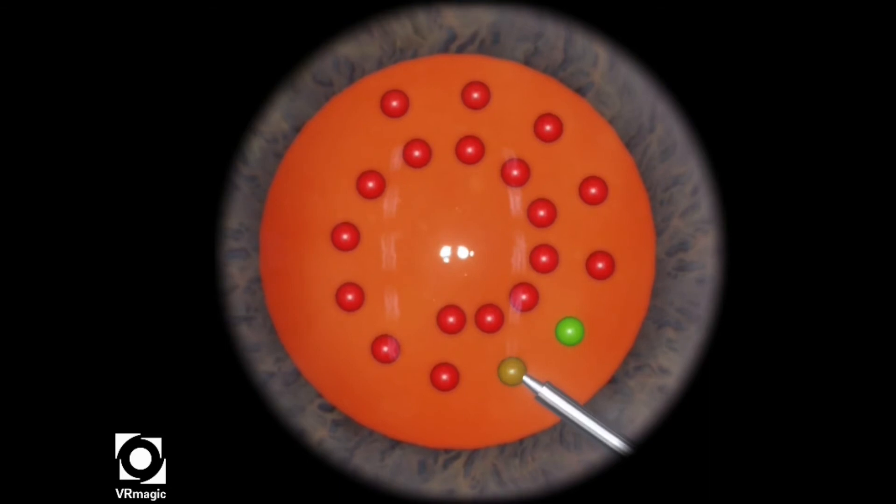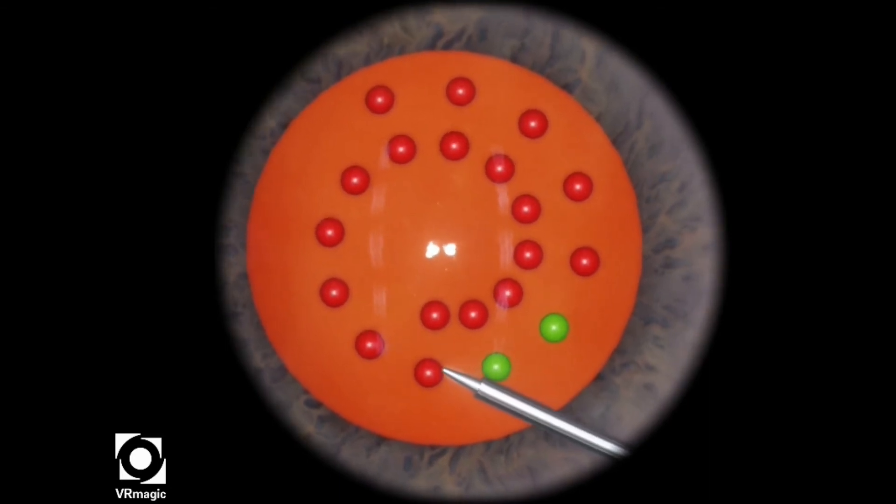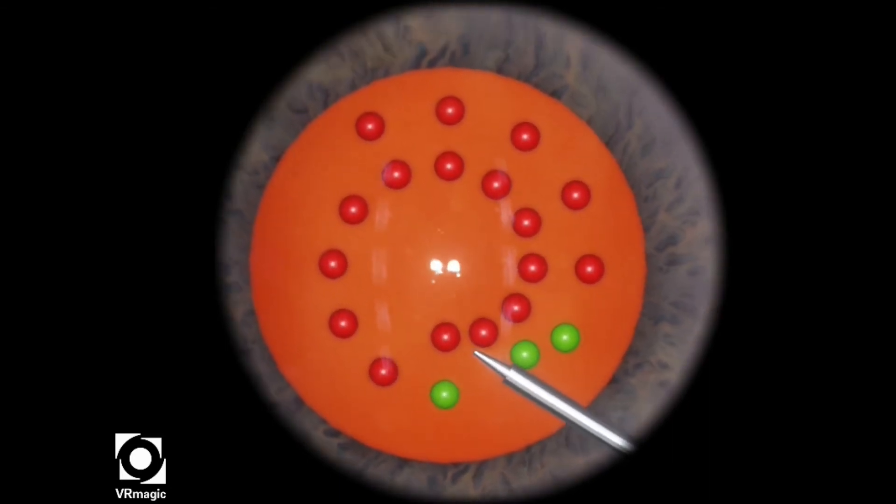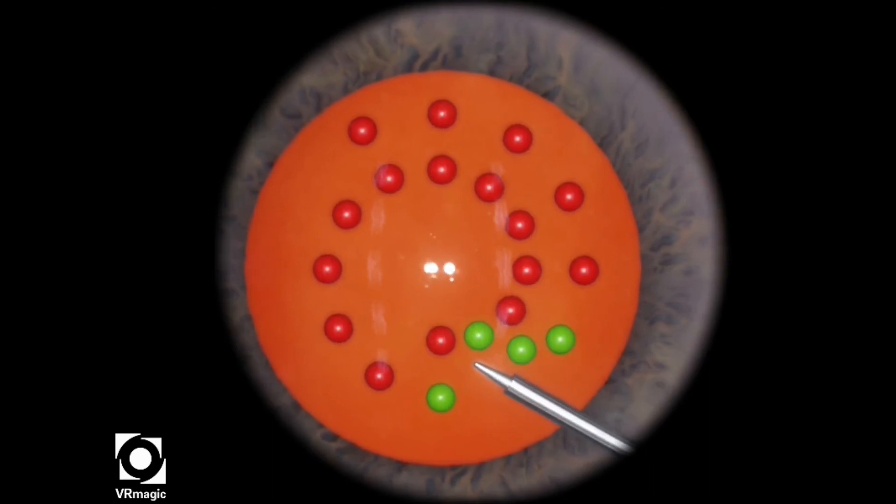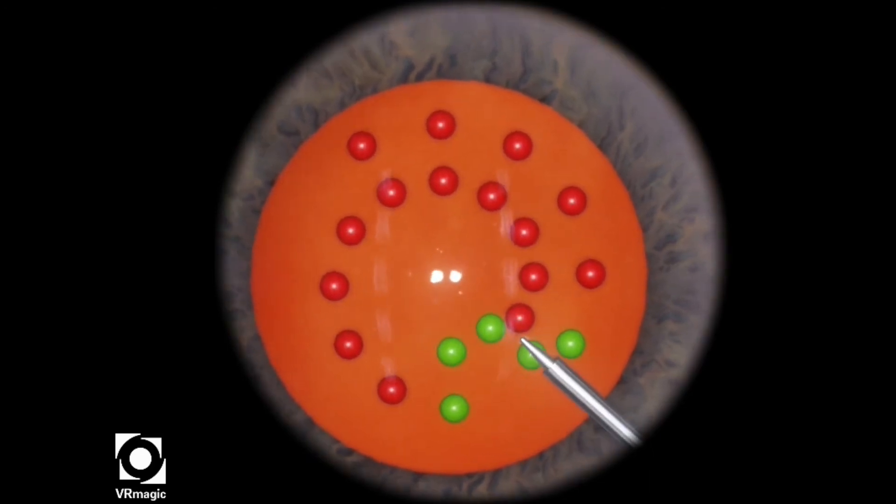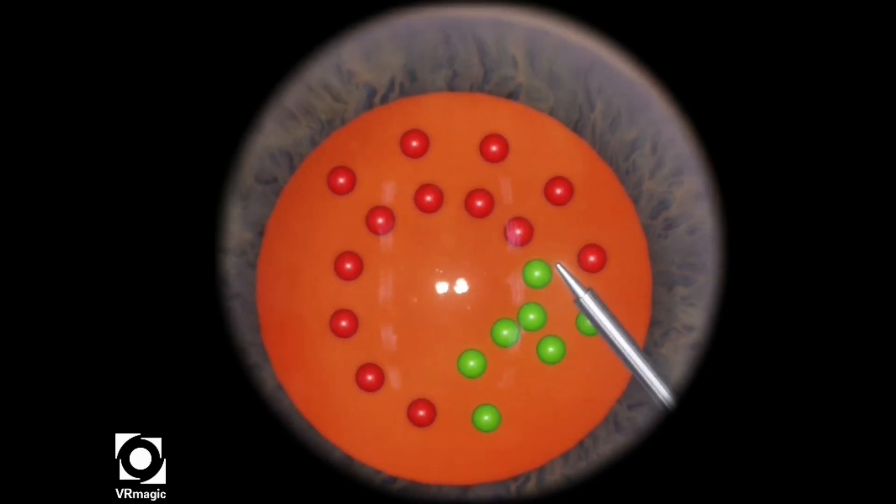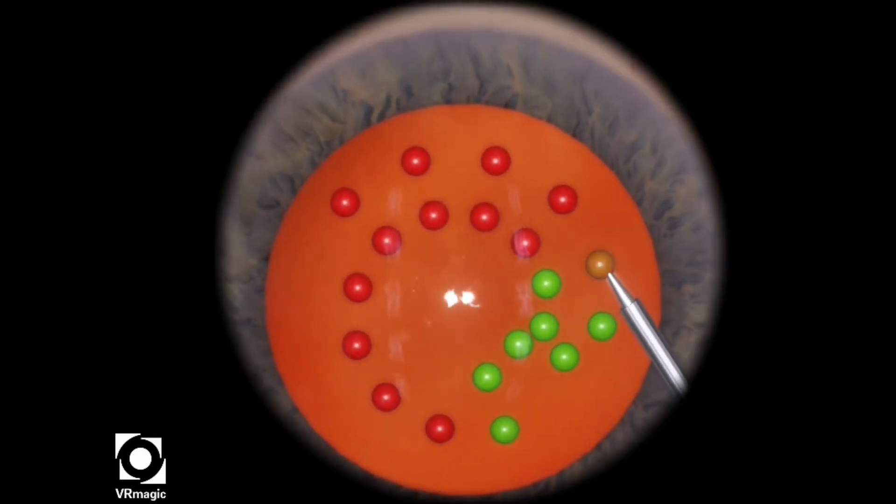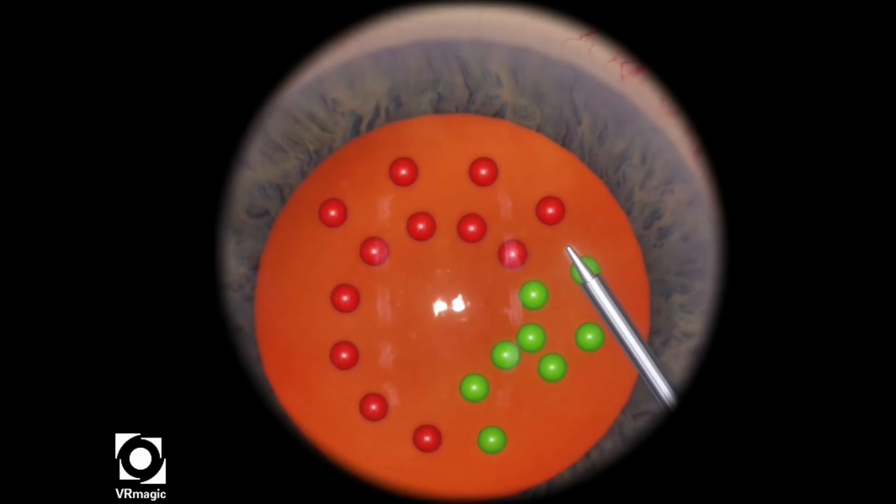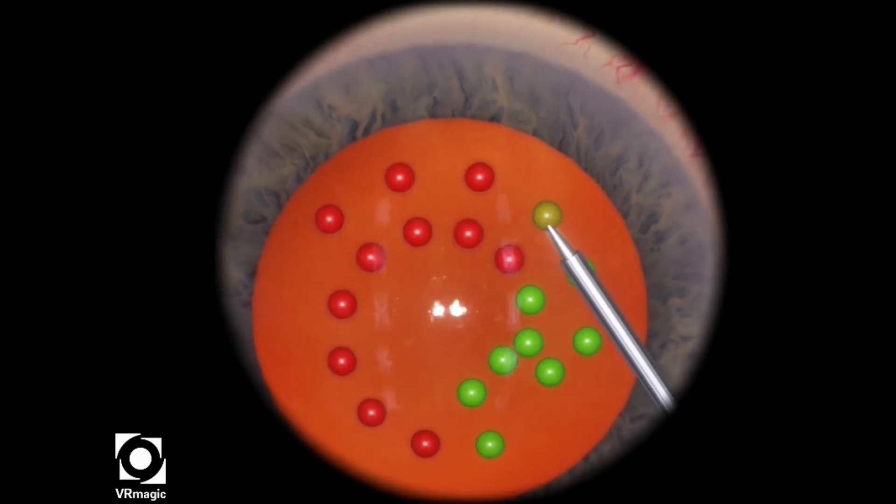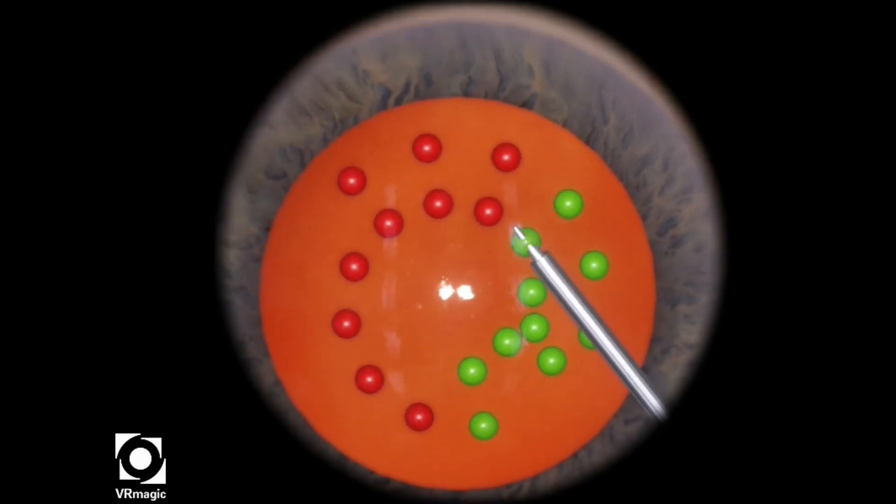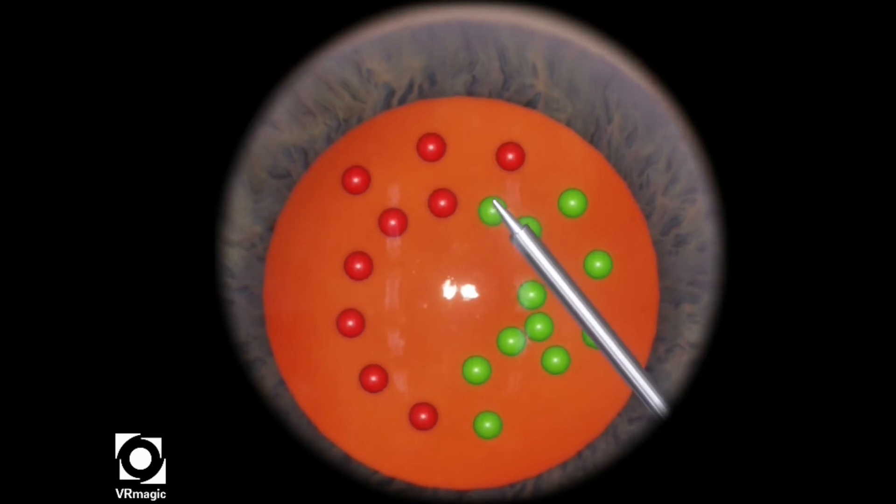So intracapsular navigation is a very interesting and a fun task and also a very important skill to have to precisely target the ball and stay within it until you reach the desired effect in the object within the posterior capsule.